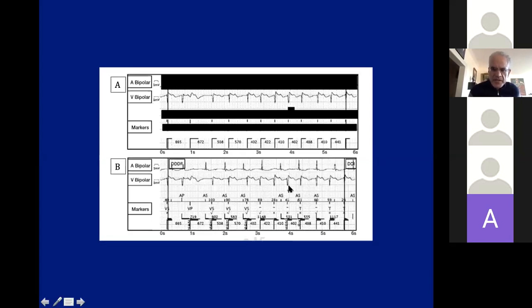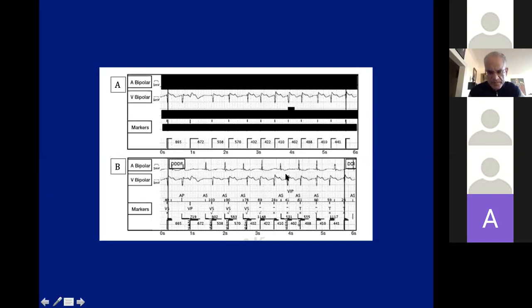This was actually VT, illustrating that the electrogram morphology can be very similar. But if you look at the atrial channel on top, you can see that there is AV dissociation. This illustrates that the atrial electrogram is actually very helpful.